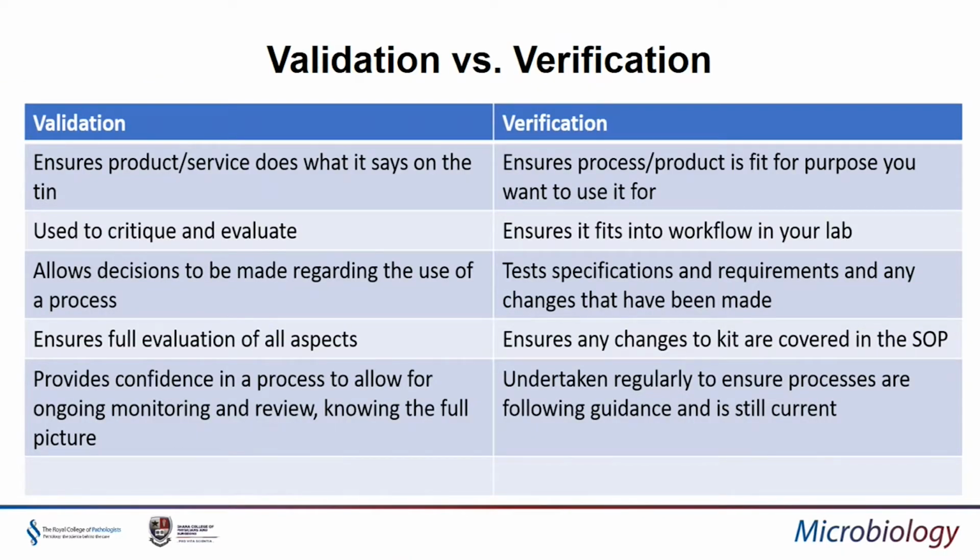Validation versus verification I'll touch on next. So validation ensures the product or service does what it says on the tin. It's used to critique and evaluate, it could be equipment, it could be a product, and it allows decisions to be made regarding the use of a process. So it may be good for one particular process, but not another. And it ensures a full evaluation of all aspects involved.